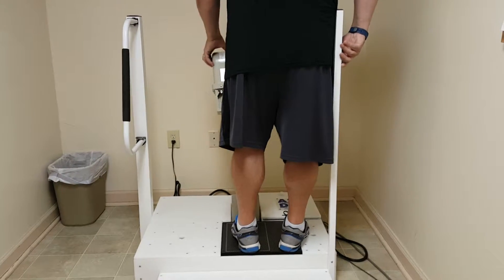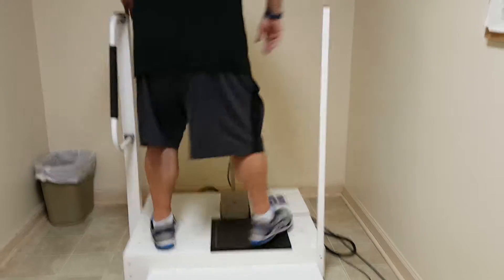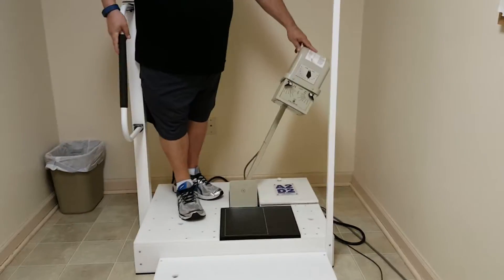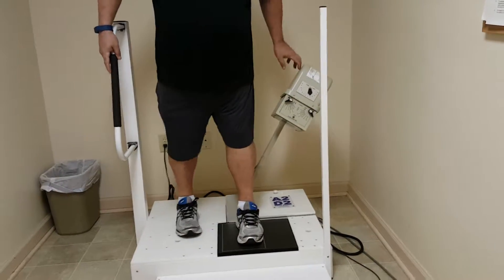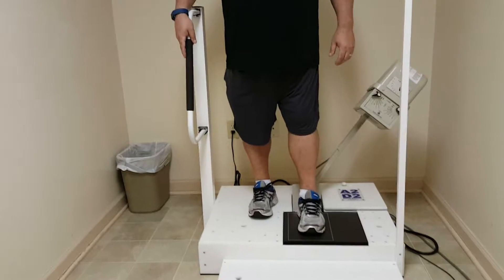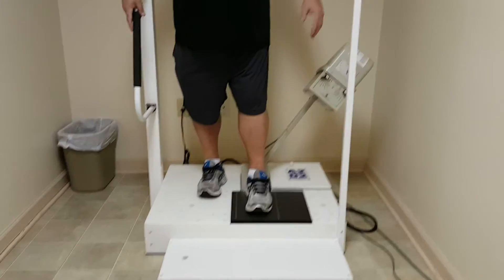If you need to get a greater angle on the left oblique, have them turn around. That'll be an exception to the rule. I can't think of any situation where we'll have to do that, but that's good to know.